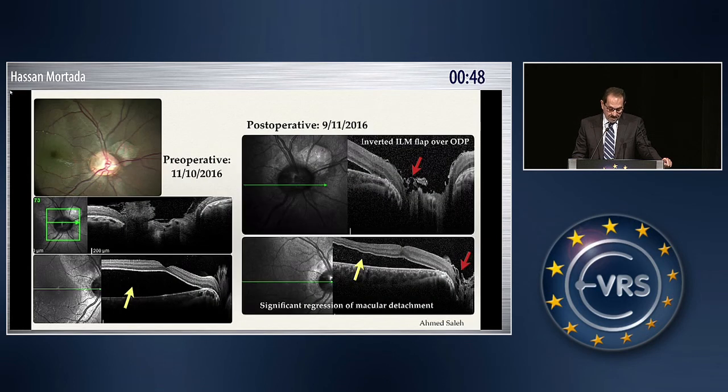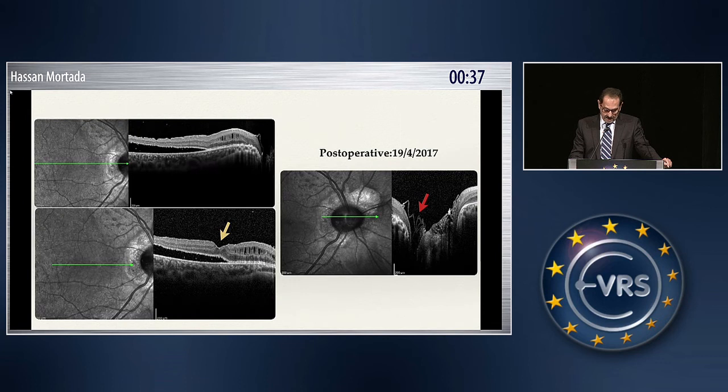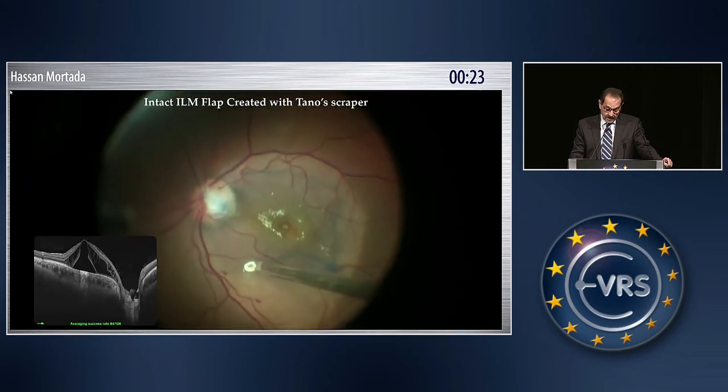This is the pre-operative and one month after post-operative. Post-operatively, there is a marked decrease in the amount of fluid. The ILM flap is inside. And if you look one year after, the flap is inside the optic pit and the macula is attached.